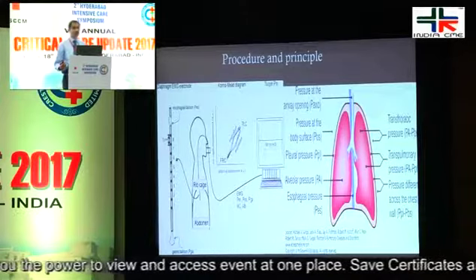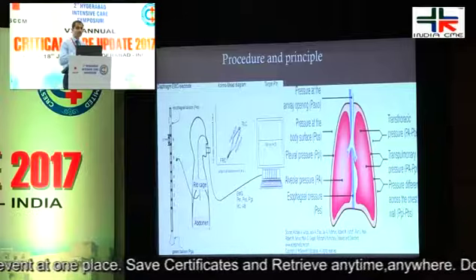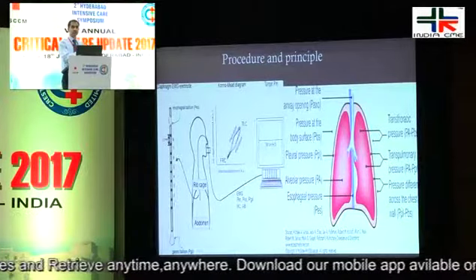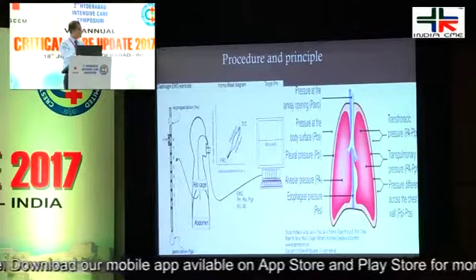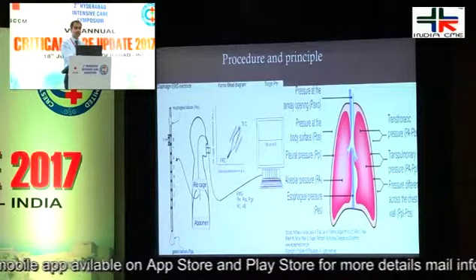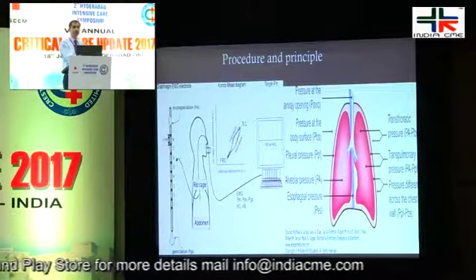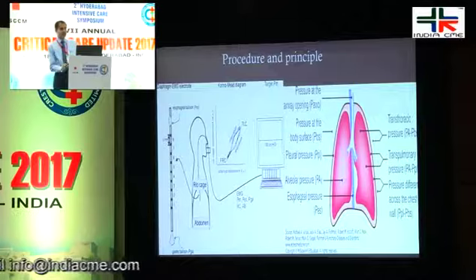The reason it is kept in the lower half is so that the effects of the mediastinum, heart, and other structures around the middle of the esophagus or a little above that do not alter the pressure monitoring that we are doing. So it is least affected in the lower half of the esophagus, and that is the reason it has to be positioned adequately.